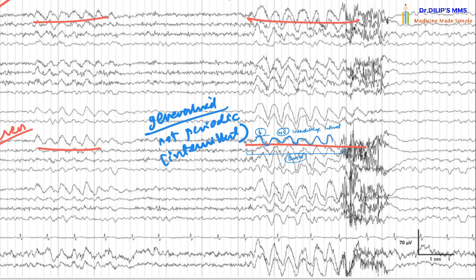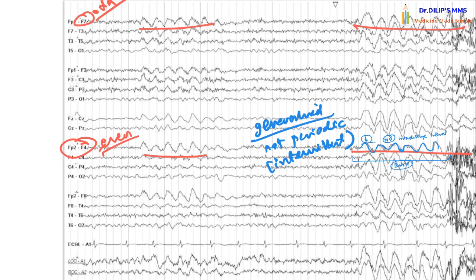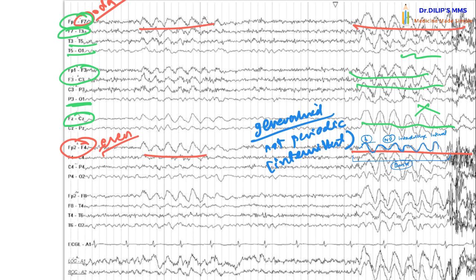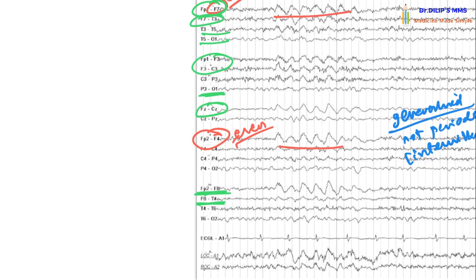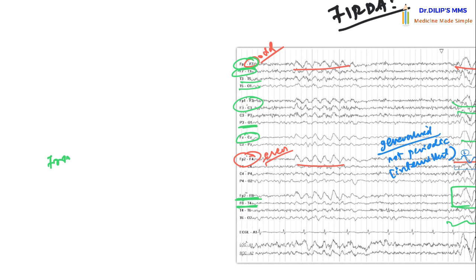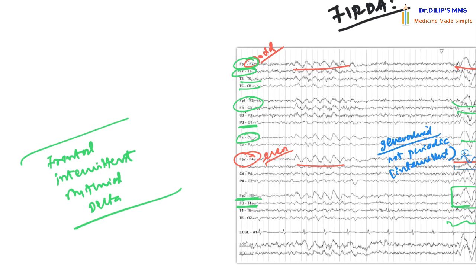One more interesting feature of this EEG is that the waveforms are predominantly in the frontal lobes. You can see clusters of waves in the frontal and frontal-temporal regions, which blunt out in the temporal and parietal regions. It is clearly most prominent frontally. So to summarize: FIRDA is generalized, intermittent (not periodic), with rhythmic delta activity predominantly in the frontal region.